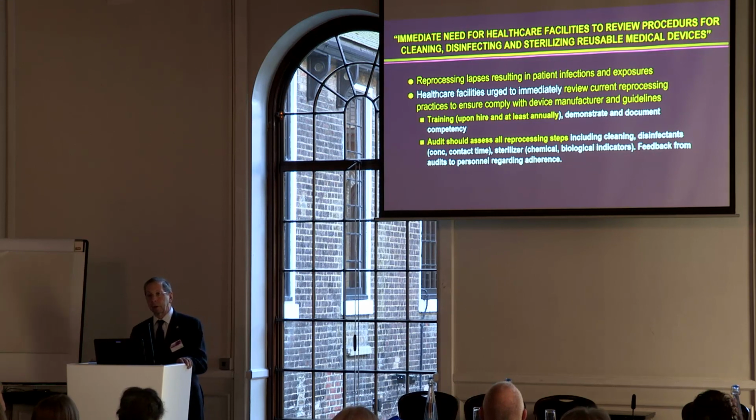And a key part of this, I should say, because this is very complex, is training upon hire and at least annually of everyone who's doing high-level disinfection. Many of the people doing this are not trained like nurses or physicians or other well-trained people, and they need very careful training. They need to demonstrate and document competency. And then there should be audits to assess all reprocessing steps, including cleaning, disinfection, concentration, contact time, the sterilizer, and feedback from audits to personnel regarding adherence.